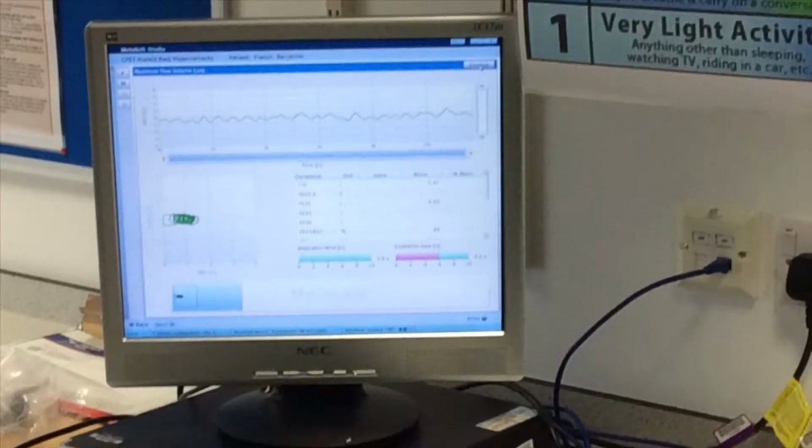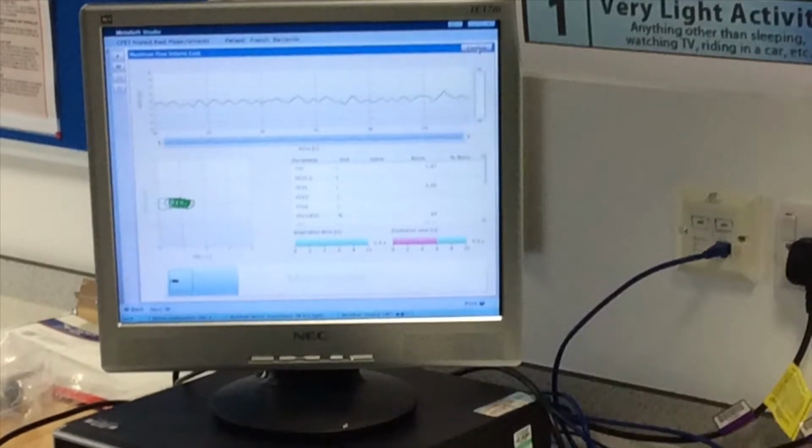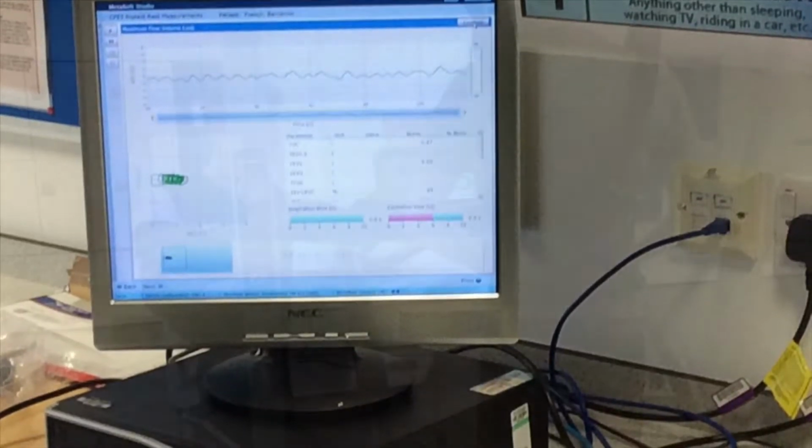Here the client's breathing is being calibrated, which will get them used to the mask and the new surroundings. For the 2 minutes it is on the individual, the computer measures the oxygen intake and the carbon dioxide outtake to understand more information on the individual.